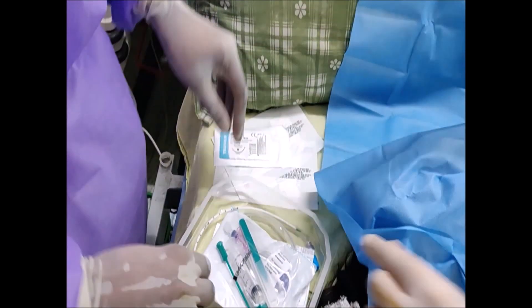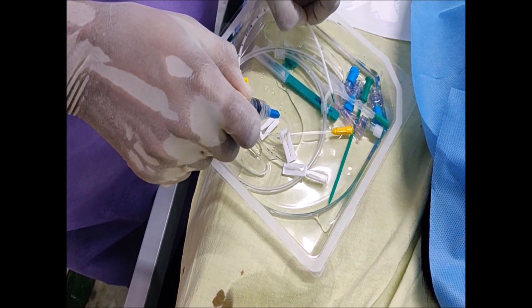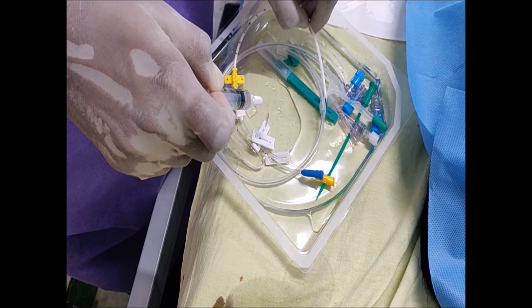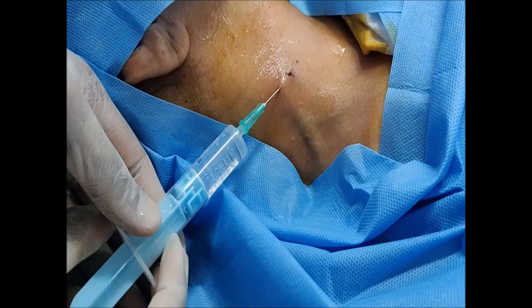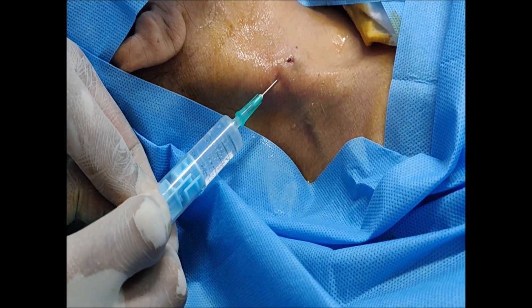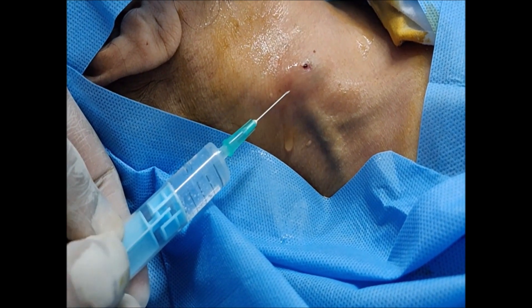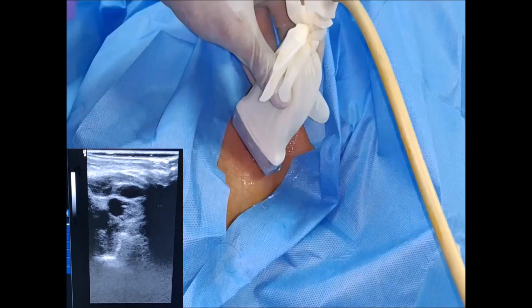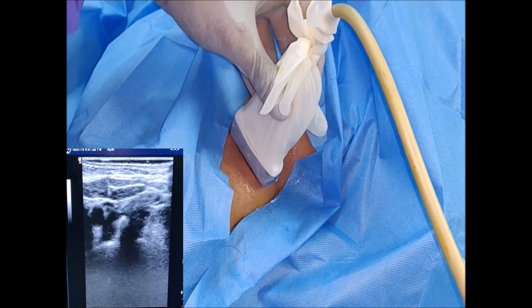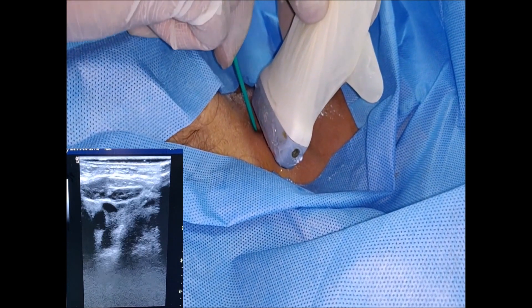Open the central line set and use heparinized saline to flush all the ports of the line. Keep the longest port uncapped so that the guide wire can be threaded through it at the time of insertion. Infiltrate the insertion site with local anesthetic such as 1% lidocaine to minimize pain. Reconfirm the position of the jugular vein by gently applying pressure with the linear probe. You can also use a dilator to mark the point of insertion.